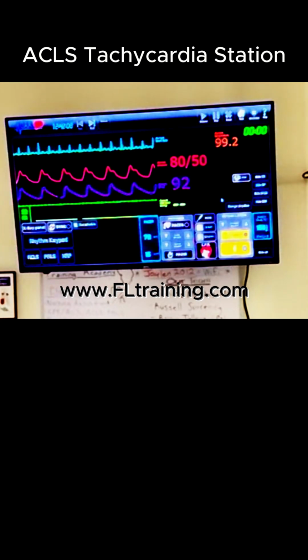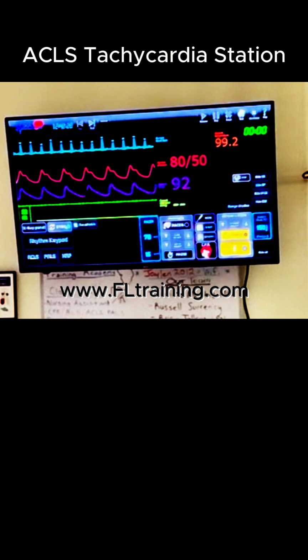So while we are drawing up that 12 milligrams of adenosine, you should be preparing your team to use what type of energy? Synchronized cardioversion. Perfect. Can you please check the defibrillating machine? All right, so we have pads on the patient. Because she is now less responsive and that systolic blood pressure is less than 90, we can give more adenosine, but since we have everything we need right there, we can also synchronize cardiovert.